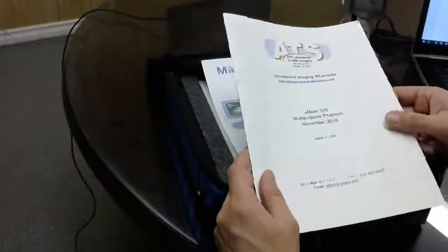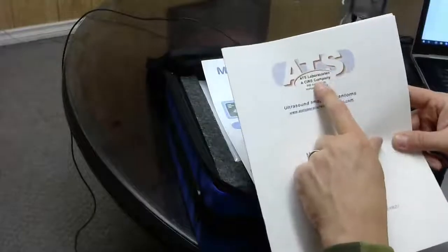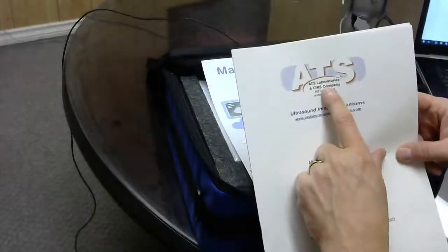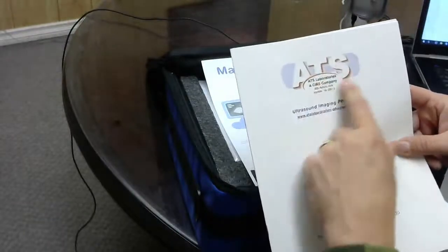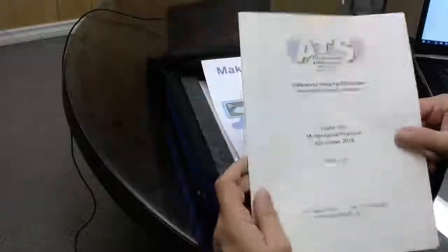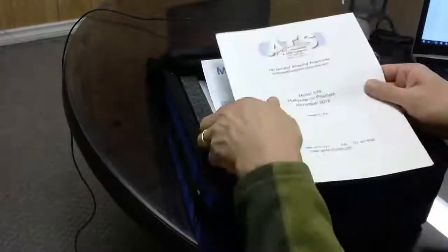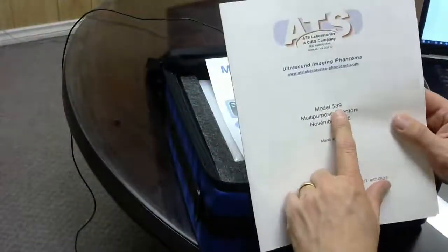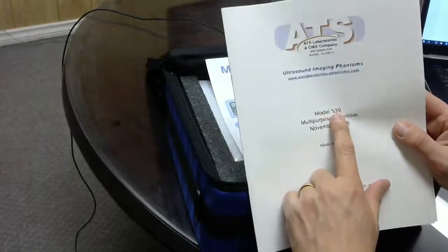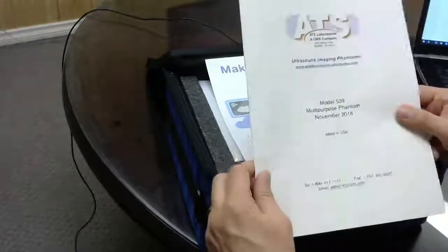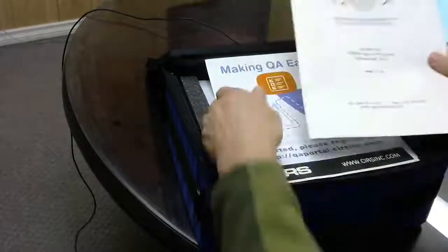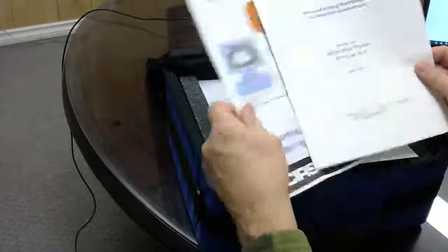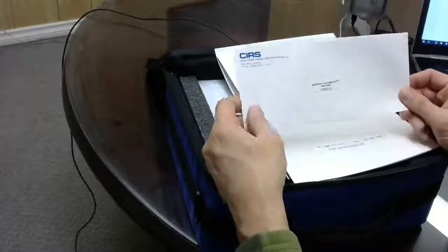Just a little explanation: CIRS purchased ATS labs, which was a separate company. So ATS is this particular phantom. The model 539 is very popular amongst ultrasound service people. It is very rugged, and we've sold a lot of them. We're happy with that.